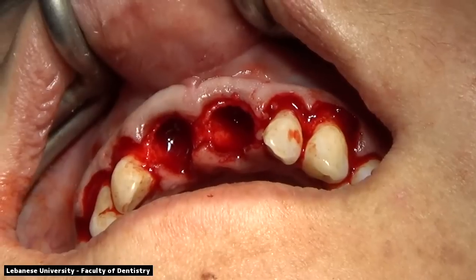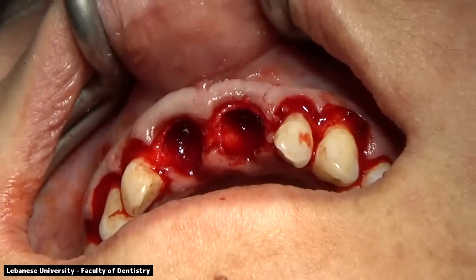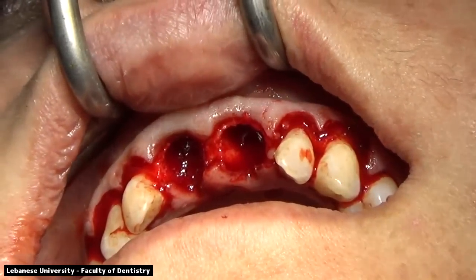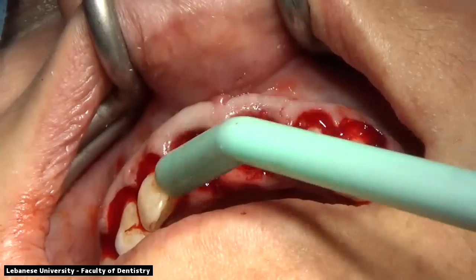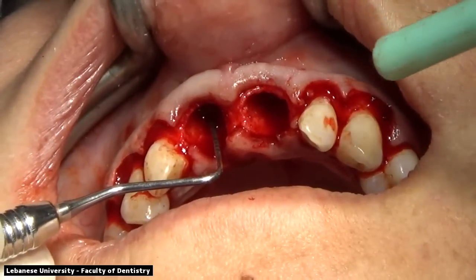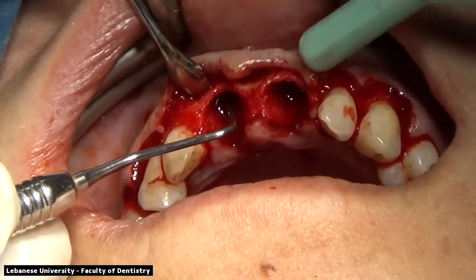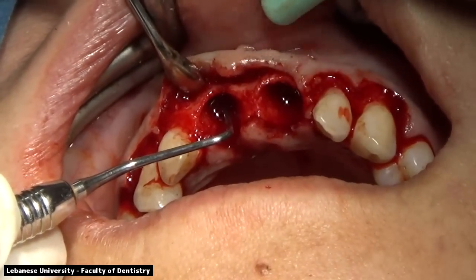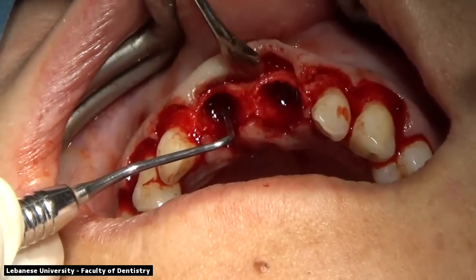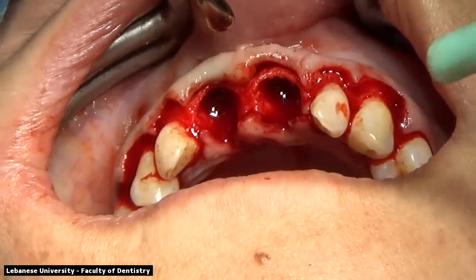We had already measured the site on the CBCT that was done previously, but we will use our perioprobe as well to go into the socket and measure the coronoapical height of the socket. So we're going in with our perioprobe and we're measuring all the way from the bone levels on the crest to the apex of the root. And the measurement is almost 8 millimeters on the right central incisor and 10 millimeters on the left central incisor.